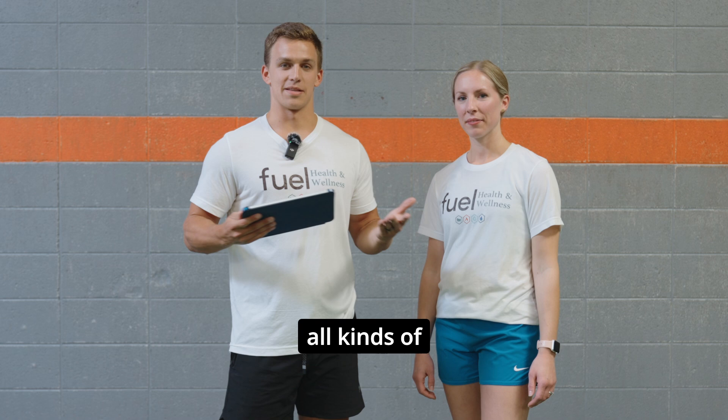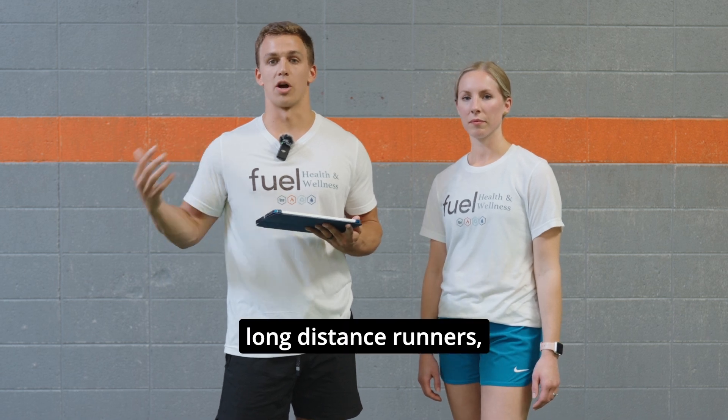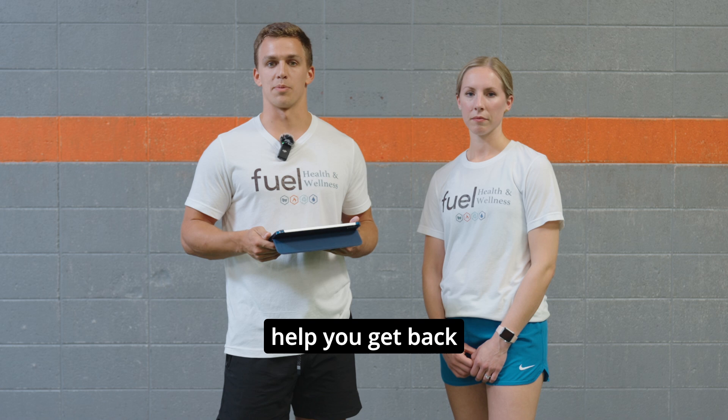Dorsa V is for all kinds of different people. If you're an athlete, this is for you as far as sport performance, injury prevention, weekend warriors, long distance runners, coaches — this could all be very beneficial to help you get back to your sport and help you prevent injuries moving forward.